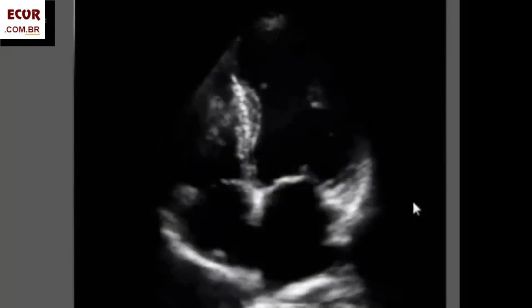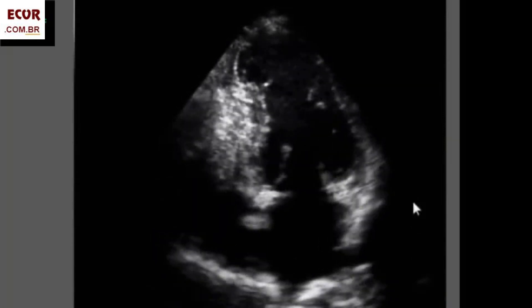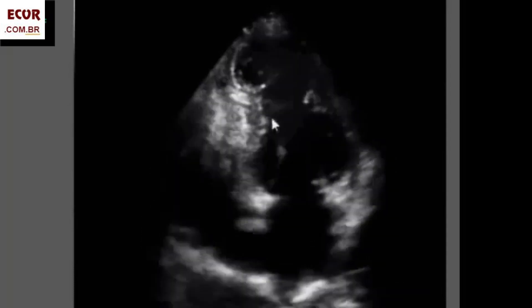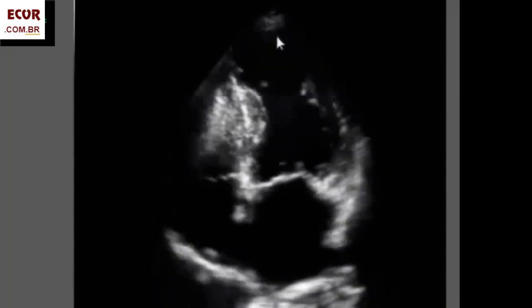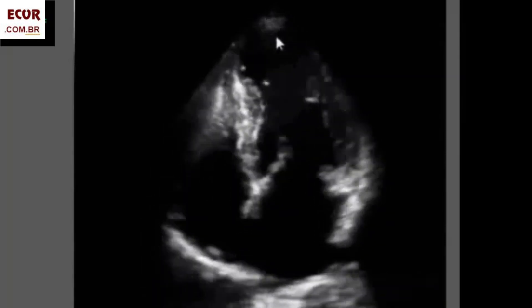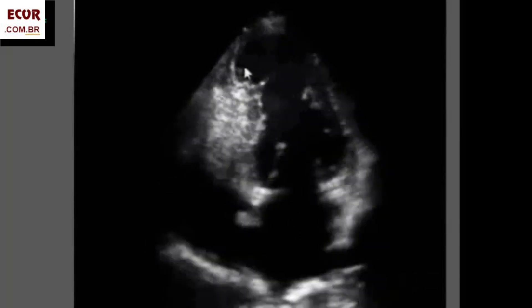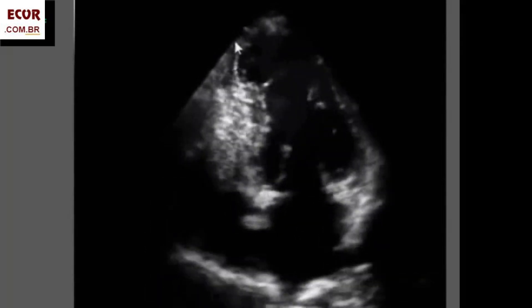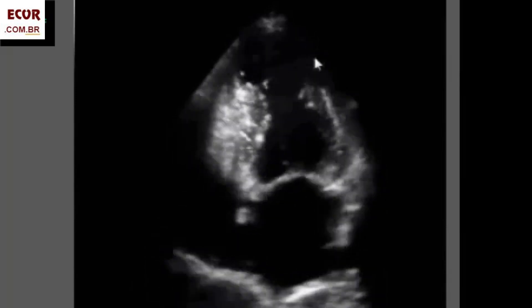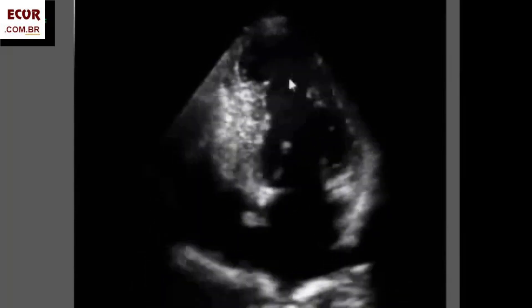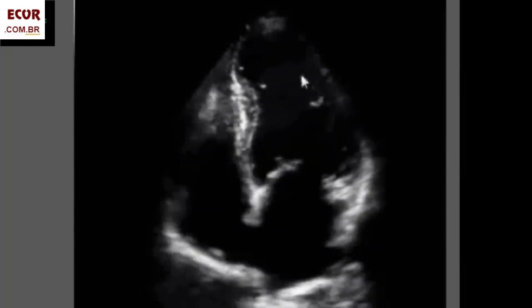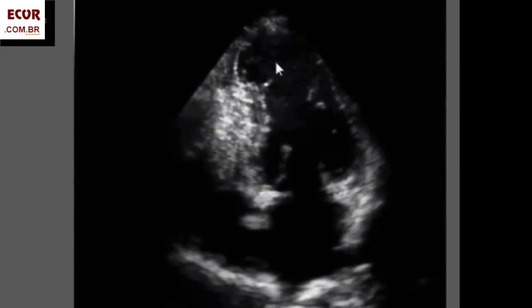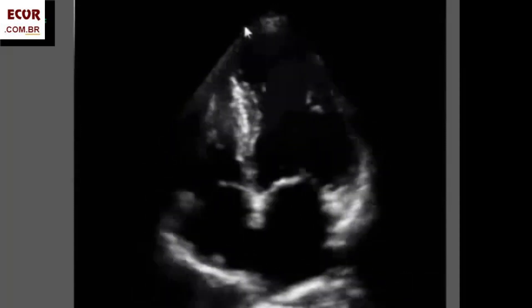One more case — apical four-chamber view. We can see here that the apex of the left ventricle — about one-half to one-third of the apical left ventricle — has an aneurysm. It is dyskinetic. We see the beginning of the neck here, and it's fibrotic — no doubts about that. It's very thin and bright, so it's fibrotic. This is the area of the neck. See how the depth of the aneurysm is large compared with the neck size.